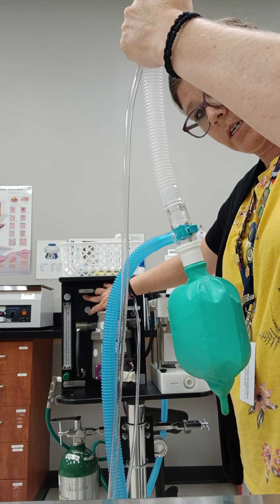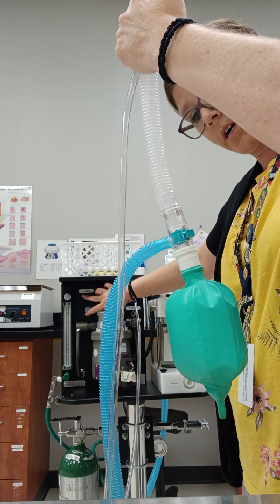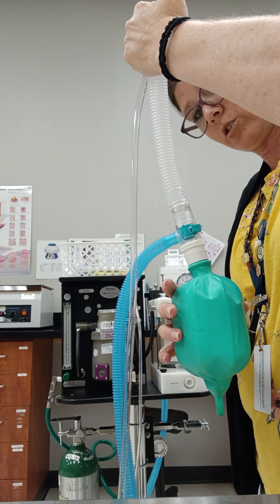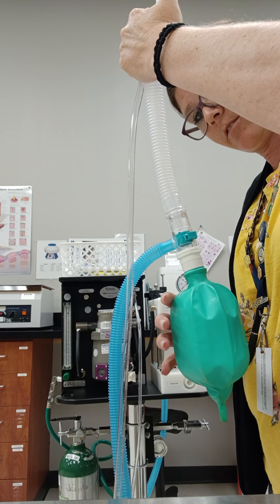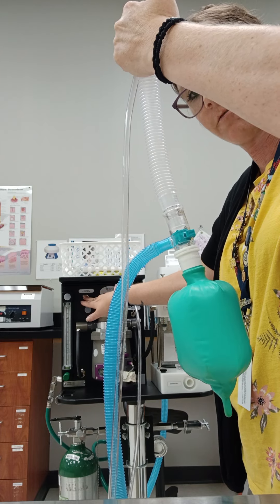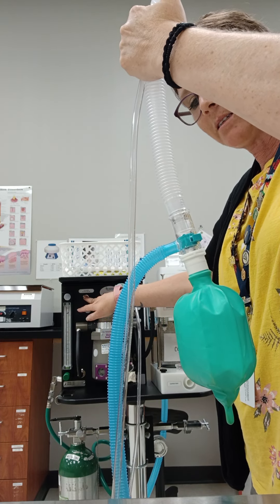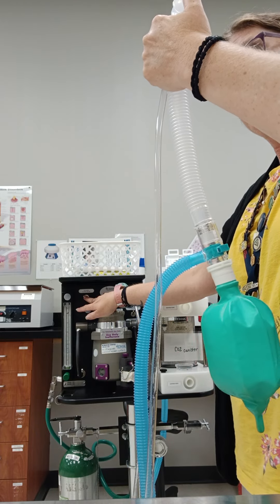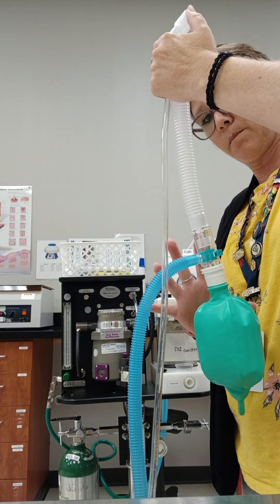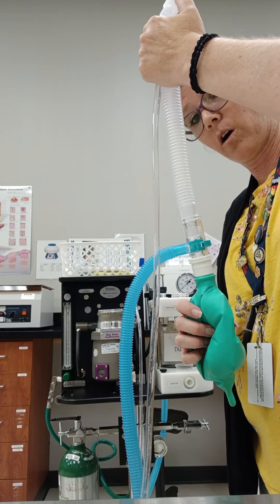This one, similar to that last machine, doesn't hold the pressure quite the way that it should. It slightly deflates after I'm hitting the oxygen flushing valve — deflating just a tiny bit. So that tells me that it's something to do with this system and or potentially the bag on this system.